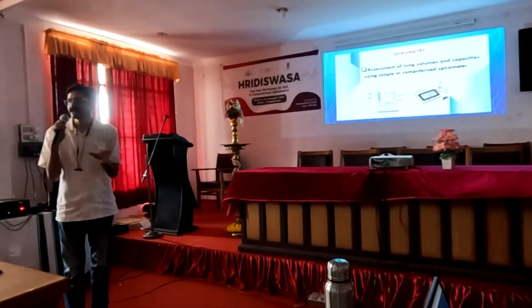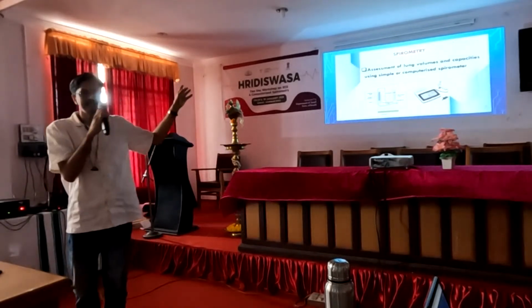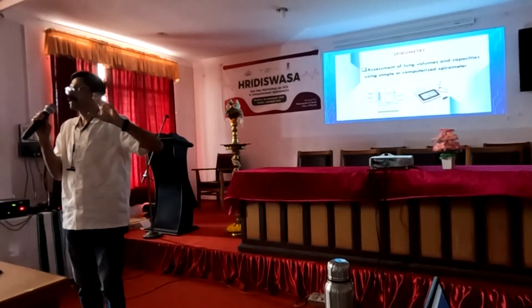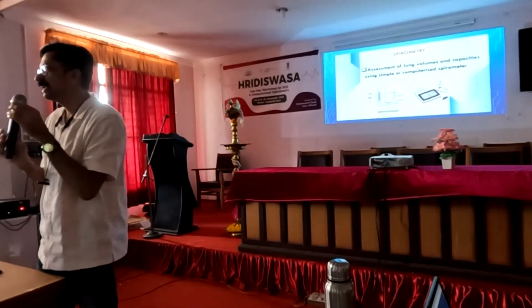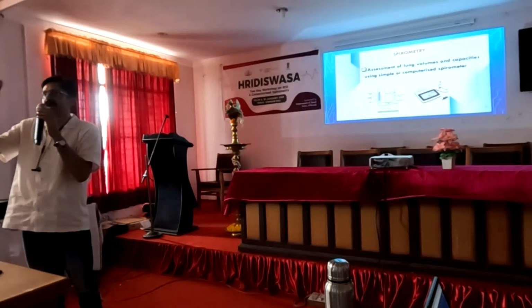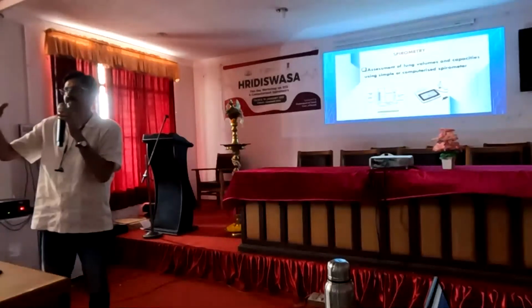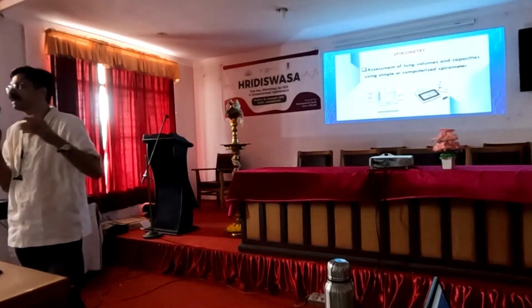What is spirometry? It is the assessment of lung volumes and capacities using a simple spirometer or a computerized spirometer. Nowadays we mainly use the computerized spirometer. The graphical representation we analyze is known as the spirogram, just like the ECG, the electrocardiogram graph.